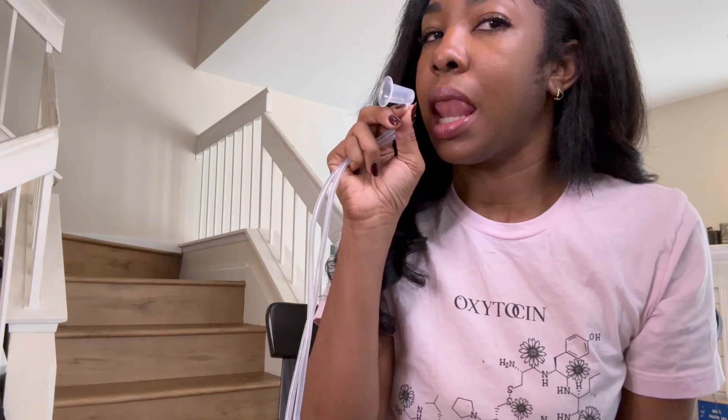So here's what an inverted nipple would look like. If your nipple goes in, even if it comes out or if it doesn't come out with stimulation, that would be an inverted nipple. And this would be a flat nipple. So I have it on the correct mode, and it gets a little bit quieter once you actually have the device on. So the correct mode is good for inverted or flat nipples. You can use this mode for up to 15 minutes, and it says that it should be painless, which I believe it should be. If there is any pain, you need to turn it off right away.